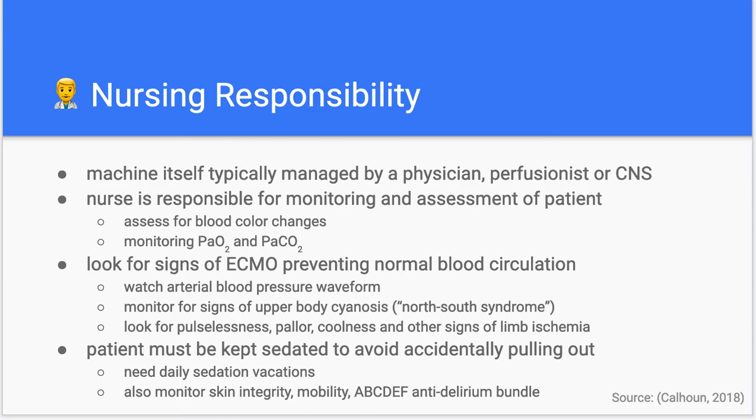And then a big thing is trying to keep the patient sedated to avoid accidentally having them pull their cannulas out. I have read stories about patients who were not sedated, and they're just told to keep very still, but it doesn't seem very wise. I'm not sure how often that's done, but we'll talk more about that here in a minute when we get to the risks and complications.